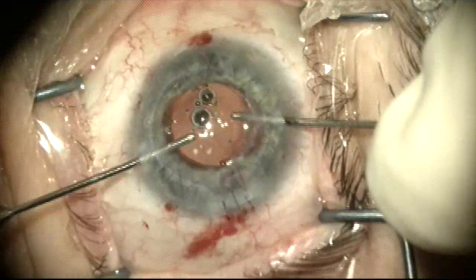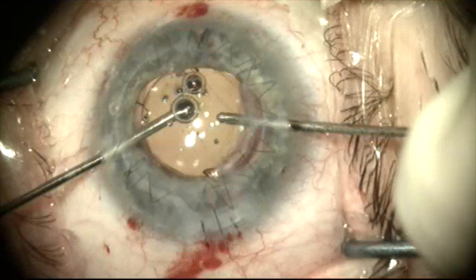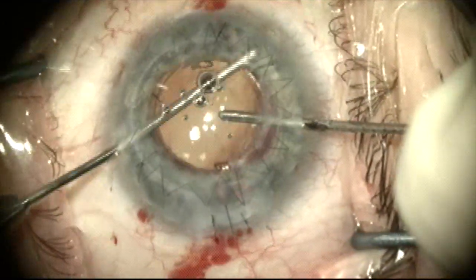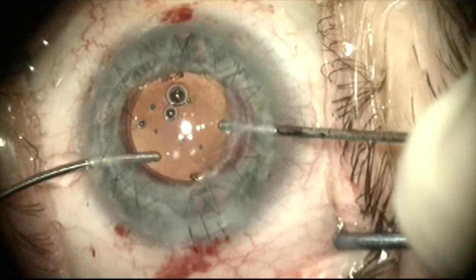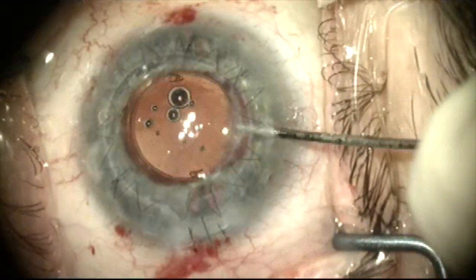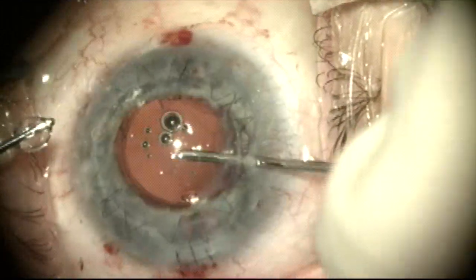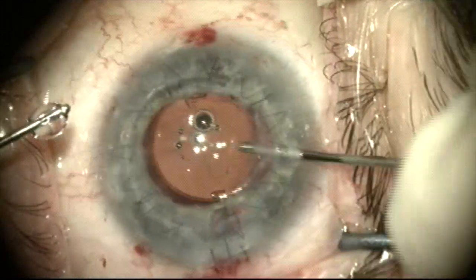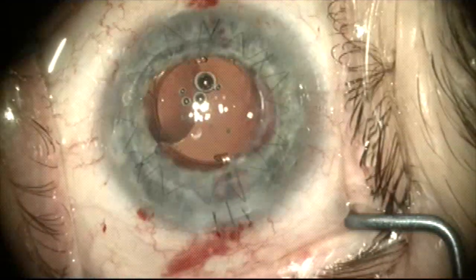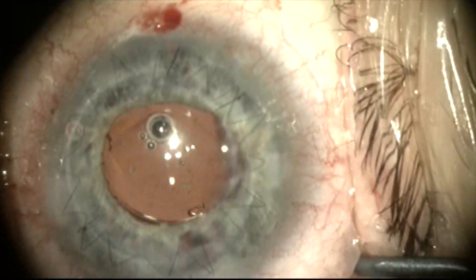The residual viscoelastic is removed and there was no evidence of any vitreous presentation. The implant seems very well supported, well centered, and in good stable position, and it did remain this way throughout the postoperative period. The patient ended up one week post-op with 20/25 uncorrected vision and has remained stable without any movement of the intraocular lens from where it was placed during surgery.